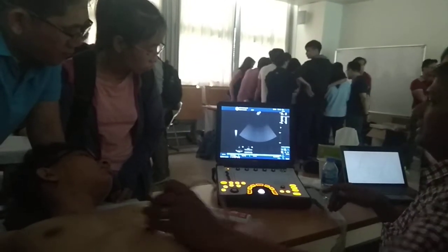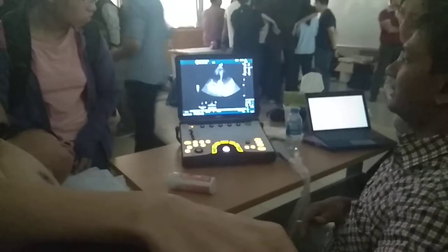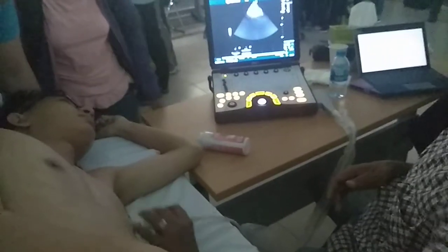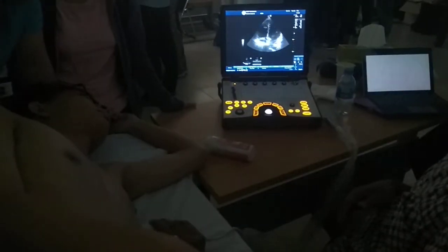And now, if I do that, can you lie slightly on your left side? Thank you. If I do that, now I'm getting everything in the one, and now everything is in.